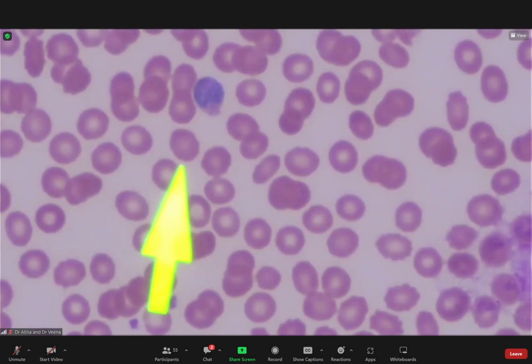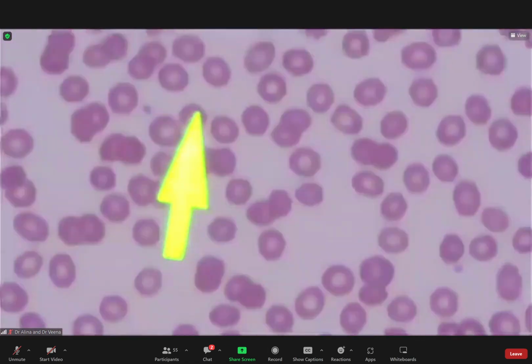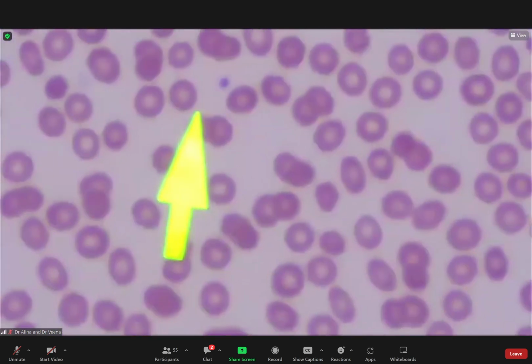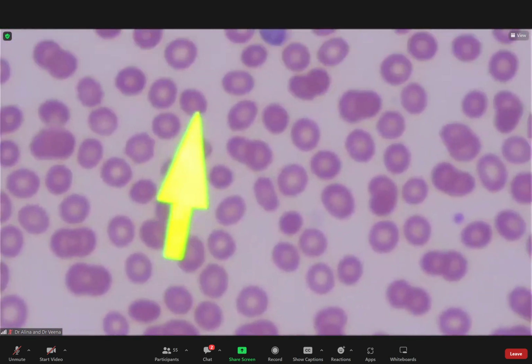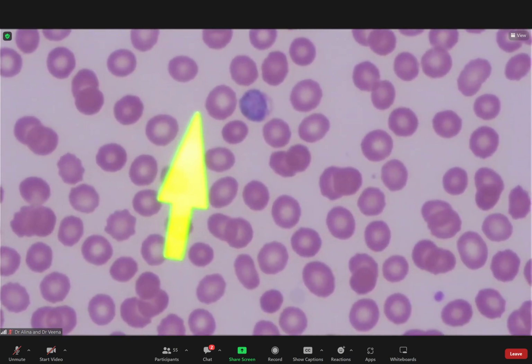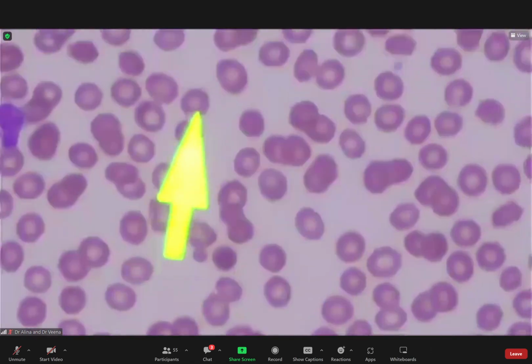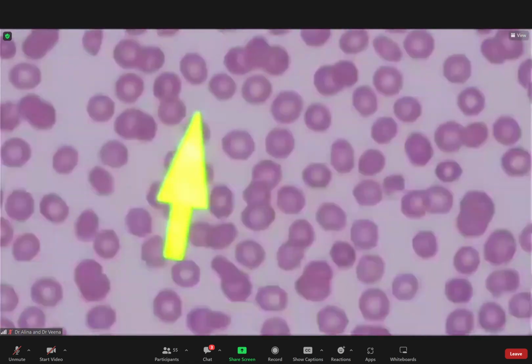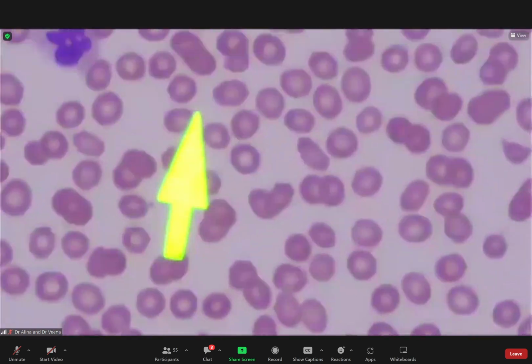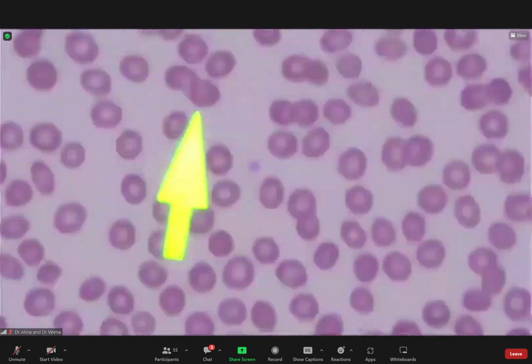Okay. You might mistake that for a platelet, a giant platelet, fair enough. I would give you that. But you scroll some more. You start to notice that, wait a minute, it's inside the red cell. So what is inside the red cell? Again here. So these are gametocytes.